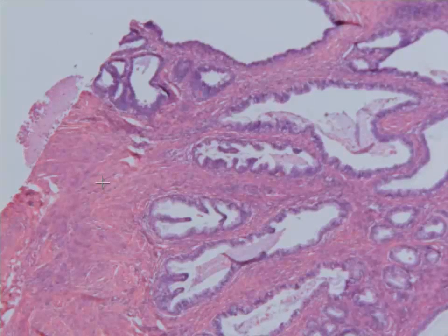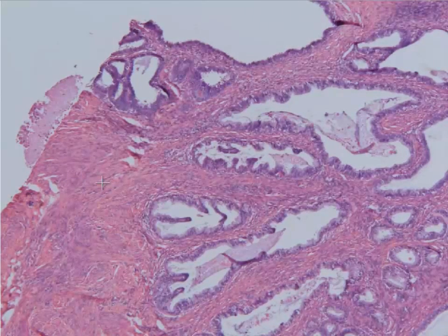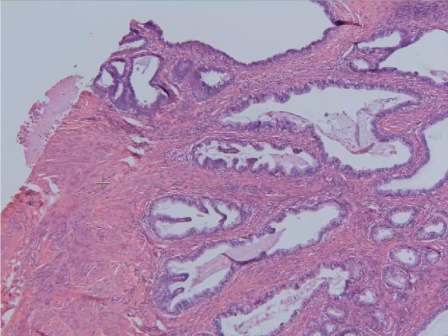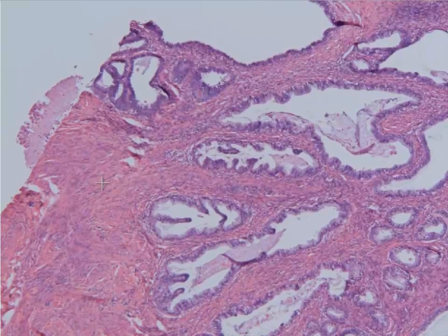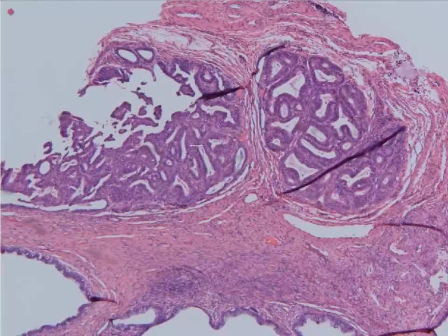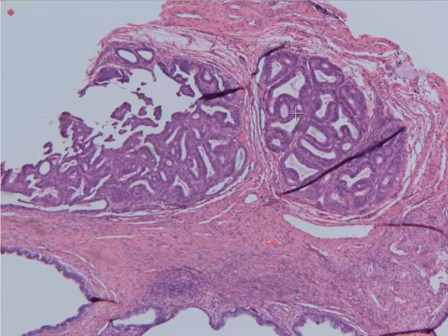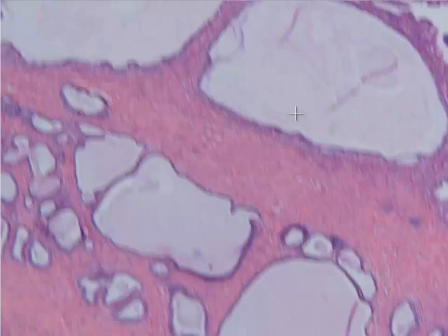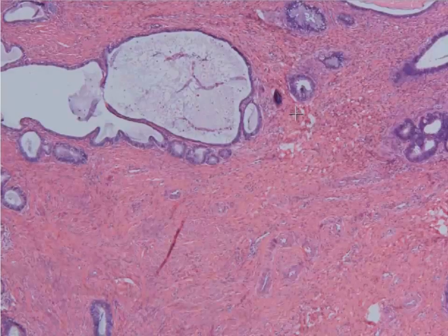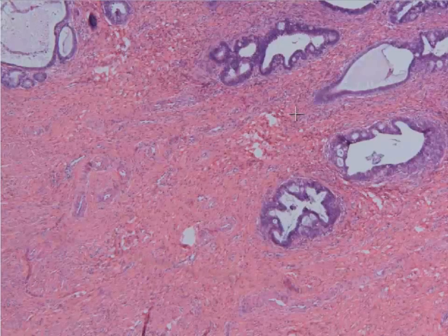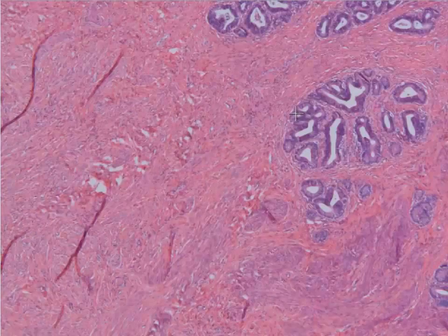This is a section of cervix from a cold knife conization specimen, where they go in with a scalpel and cut out a large piece of cervix in order to get around a tumor such as this. As we look around, there is definitely a lot of glandular proliferation composed of malignant appearing glands, and you can see that they go deep into the stroma and form small nests. This would be an invasive endocervical adenocarcinoma of the cervix.